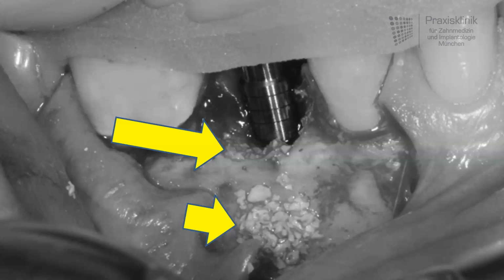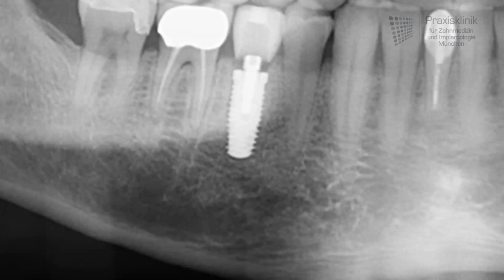And what you can see here, we've placed the implant, put an impression coping on top of the implant so that the technician knows the position of the implant, and produce the temporary immediately, so that the patient can go home with the tooth on the same day he had the operation. So tooth out, implant in, filling again the defects with bone grafting material, and then take an impression, send it to the lab, and 1 hour later the patient can go home with the temporary.